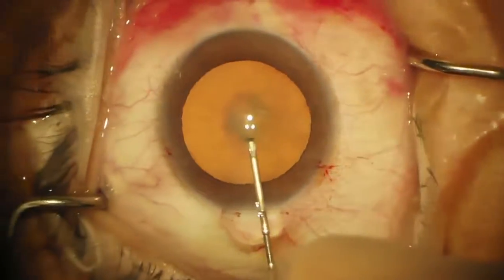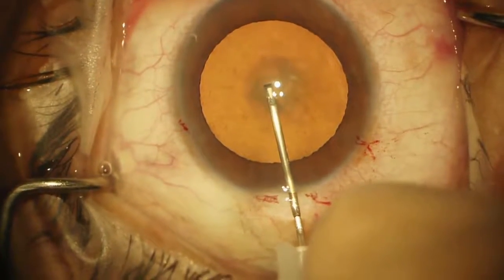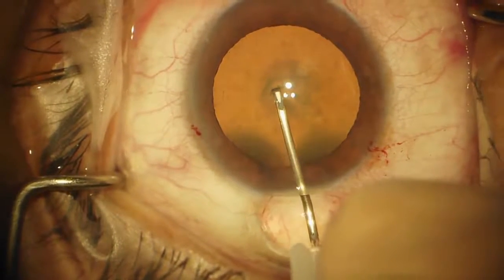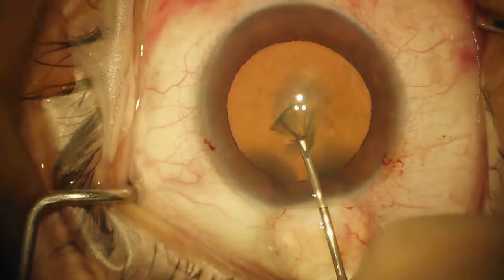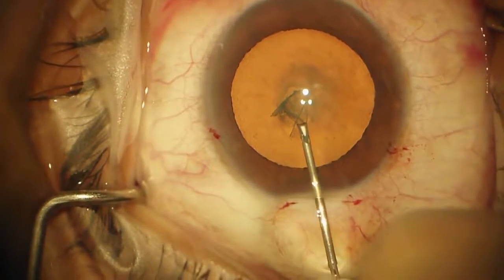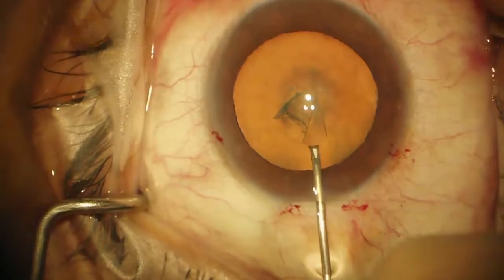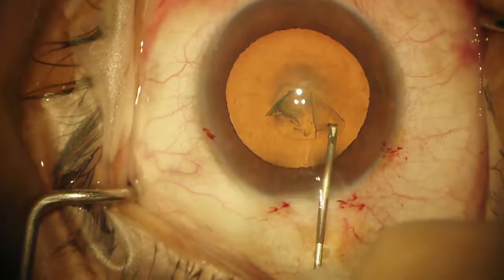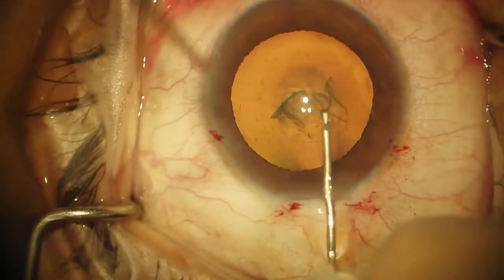The nice thing about doing capsulorhexis with a needle is if you need to, you could actually do this through a paracentesis, although it's nice to have the extra room through the main primary incision. We're just going to make a few punctures and then pull, and you get the capsule to fold over so that you work from the underside, as you can see here. This allows you to guide it along and create a capsulorhexis.